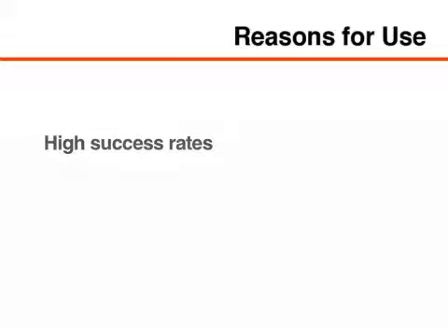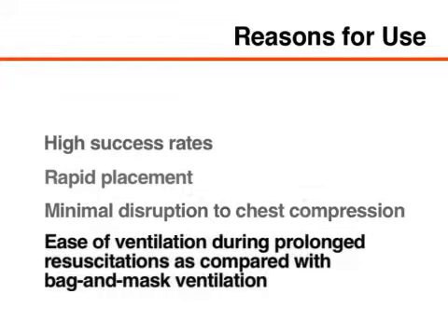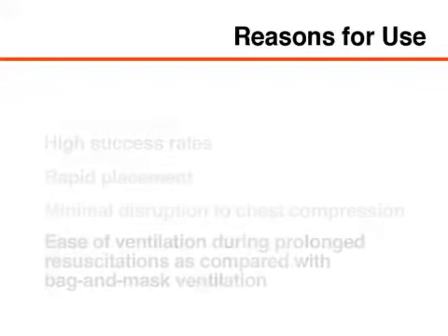The reasons for laryngeal mask airway placement during CPR are many and include high first-time success rates, rapid placement by both novices and experts, necessitating minimal disruption, if any, of chest compressions, and ease of ventilation during prolonged resuscitations as compared with bag and mask ventilation.